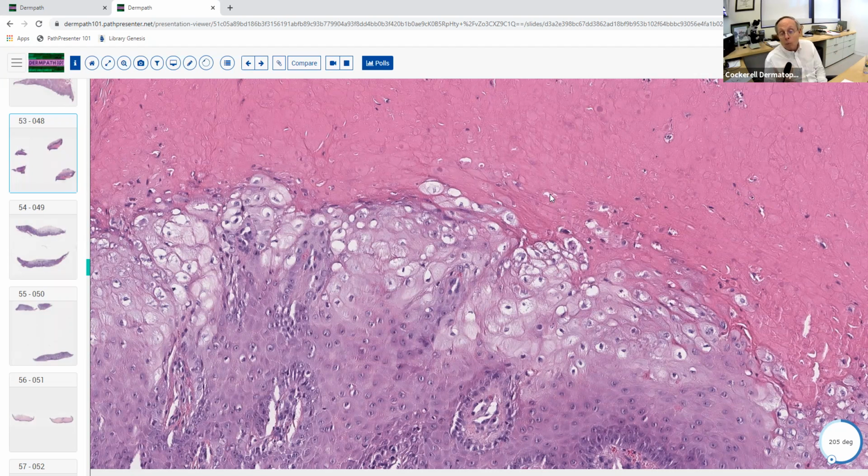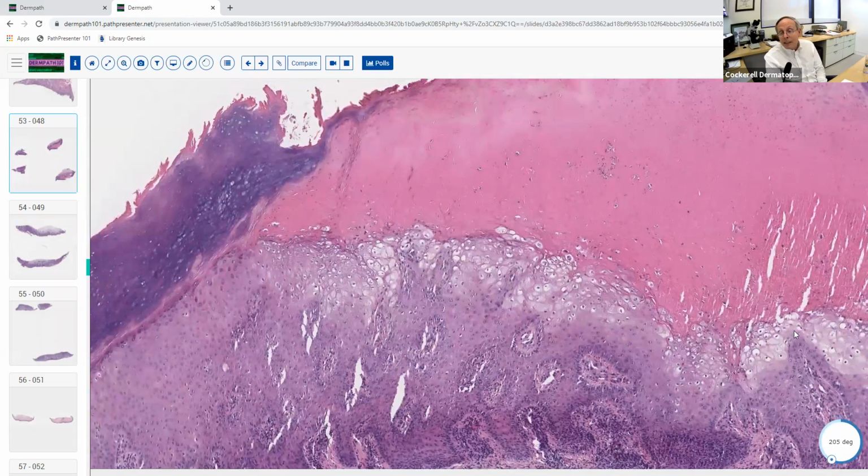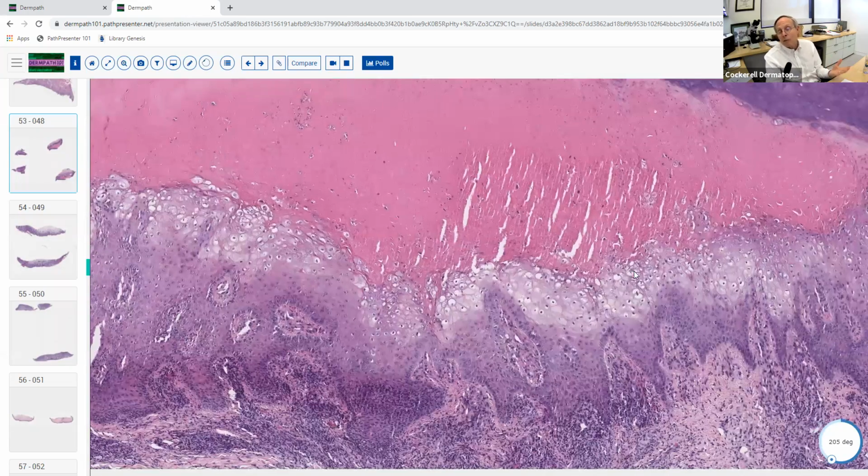So this is a pox virus or parapox virus, if you want to think that. Parapox is really the right answer, but they wouldn't choose those. But just recognize this is ballooning degeneration. Now, anytime you get ballooning, think virus. You should think of the possibility of nutritional deficiency also, but I really always want you to think ballooning equals virus most of the time. And if you see oral hairy leukoplakia, that's caused by Epstein-Barr virus, that gives you ballooning degeneration. This gives you ballooning degeneration. Herpes virus gives you ballooning degeneration. So think, especially these DNA viruses, and these are DNA. I recommend spending a little time learning about that too.